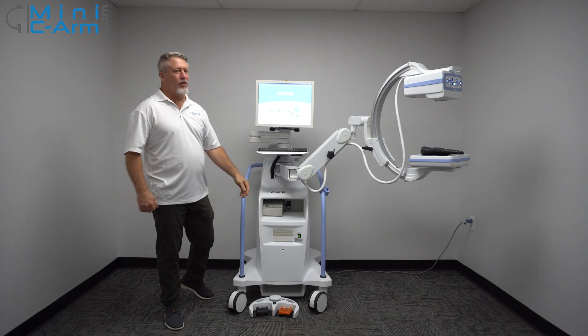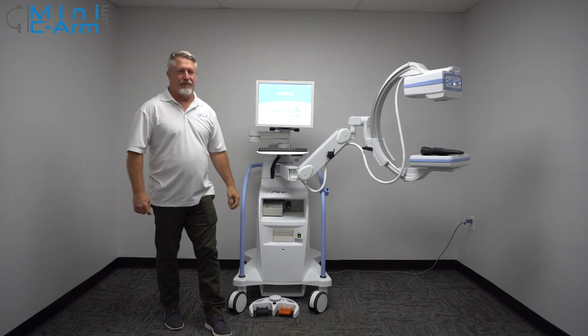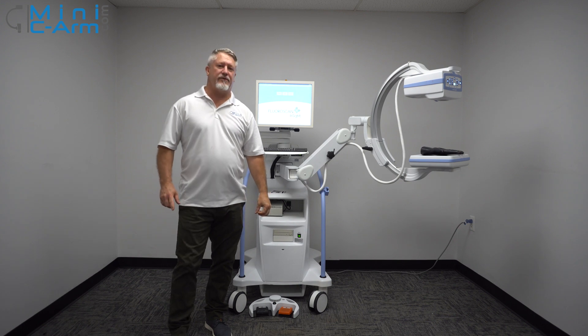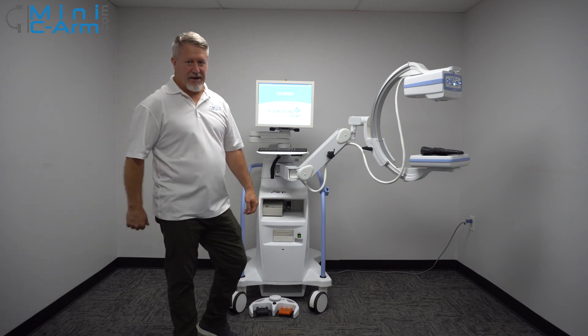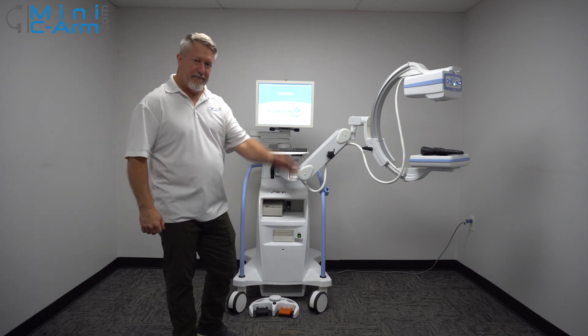This is the overview of the Hologic Insight FD. If you're interested in sales or service, please give us a call at 800-643-2998, or just send us an email at info@MiniCArm.com. Thank you.